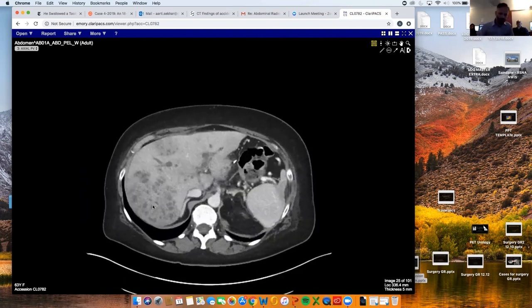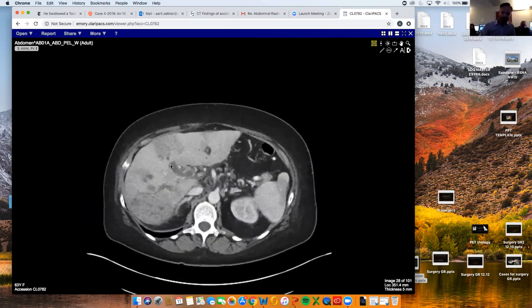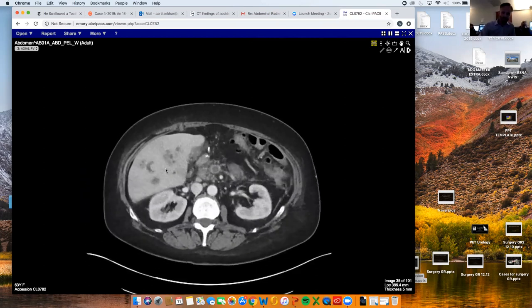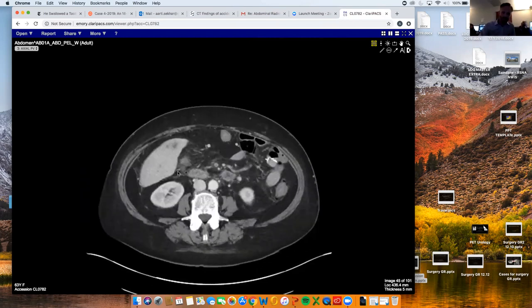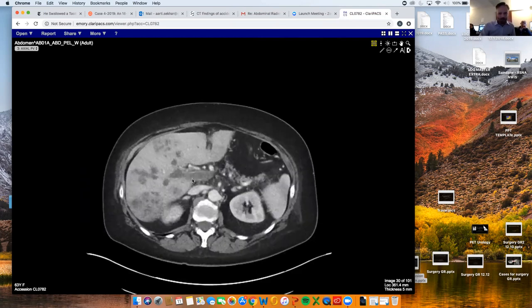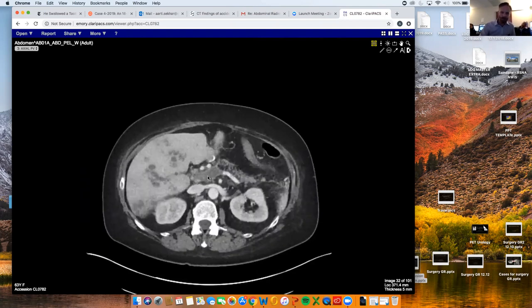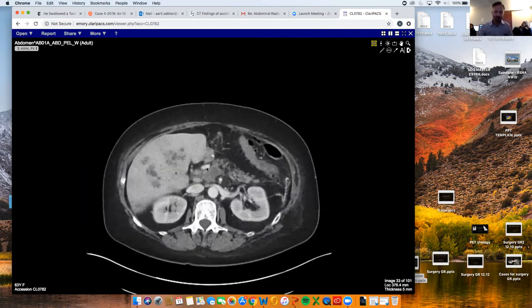And then we see all these tiny little hypodense lesions that are clustered around the portal system. And then we look again at the portal vein and notice how the walls are enhancing — you normally don't see the walls like that. So we've got diffuse enhancement and a little bit of stranding around it.